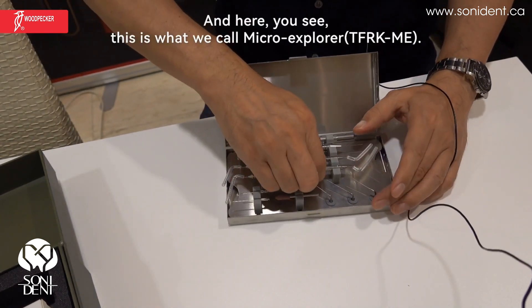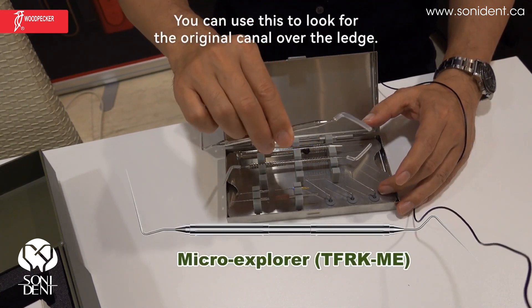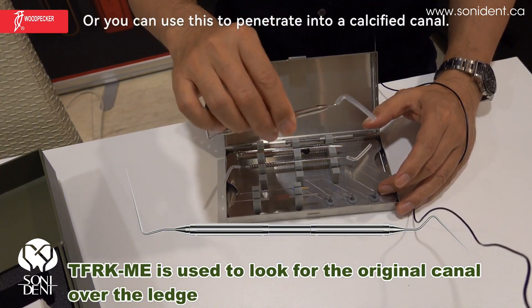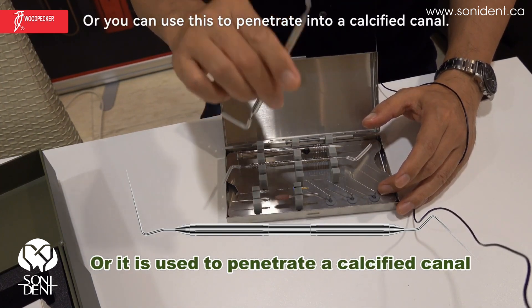Here you see this is what we call the micro explorer. You can use this to look for the original canal orifice, or you can use this to penetrate into a calcified canal.